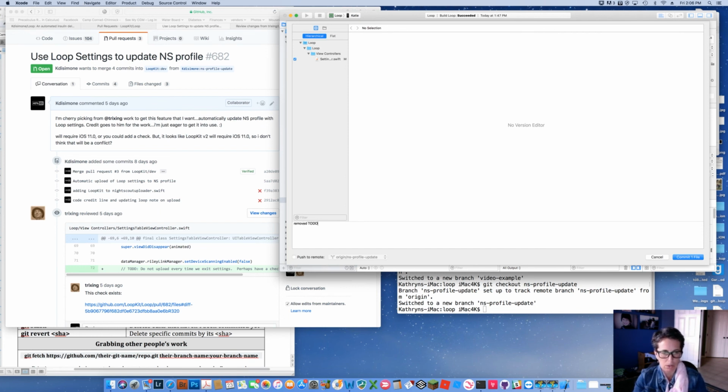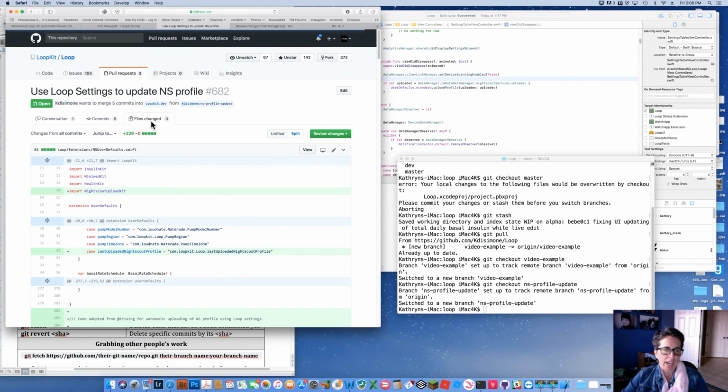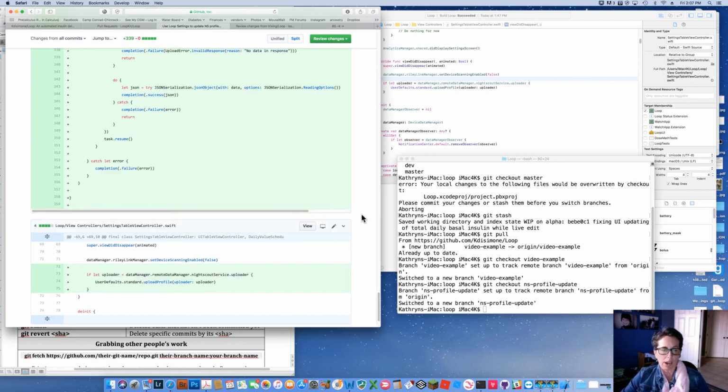Removed to do. I removed it. I'm going to push it back up there. I'm going to commit it. Because it updated my local, it also updates my version that was sitting on here. And now you can see that actually that file is no longer going to be a problem. It's gone. So by updating my repository, it updates any PRs that I have outstanding.